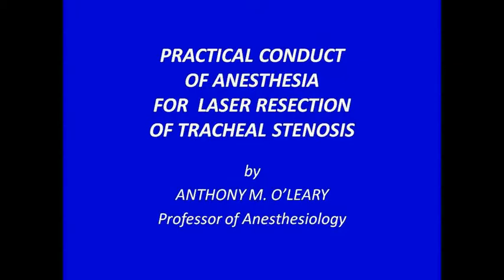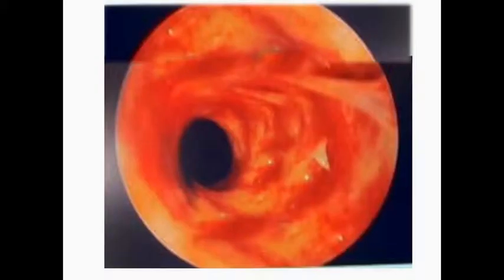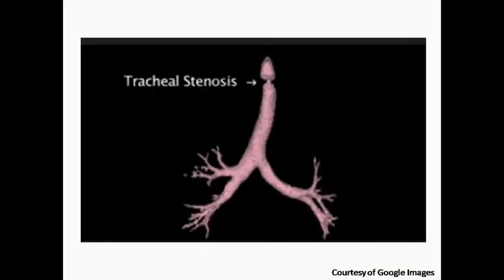Practical conduct of anesthesia for laser resection of tracheal stenosis. Here is an image of a severe tracheal stenosis requiring surgery. This image shows a radiological reconstruction in 3 dimensions. You see the tracheal stenosis near the top of the trachea.